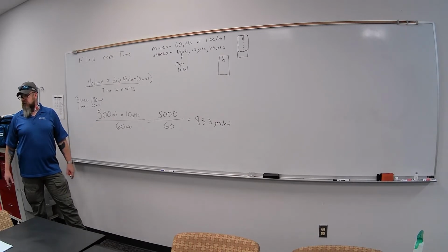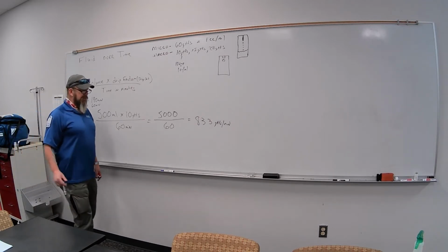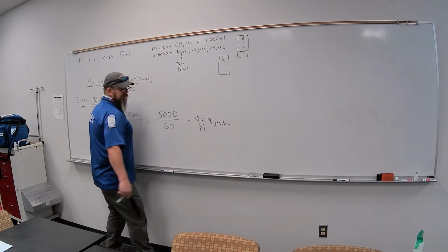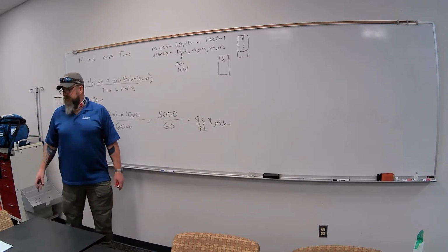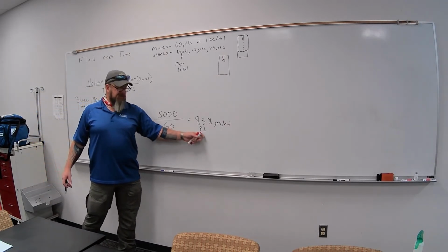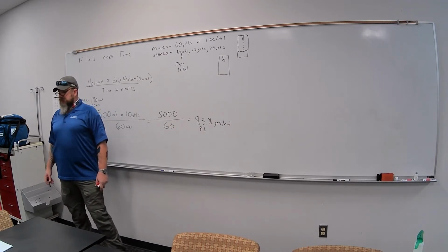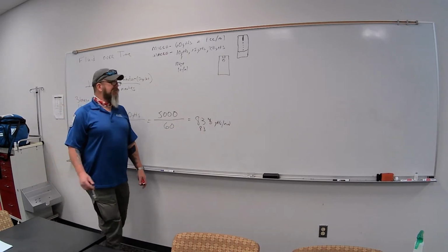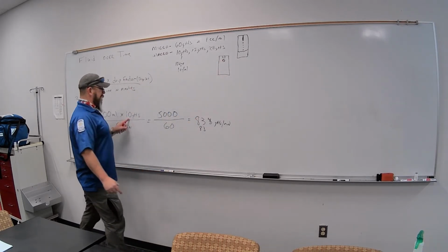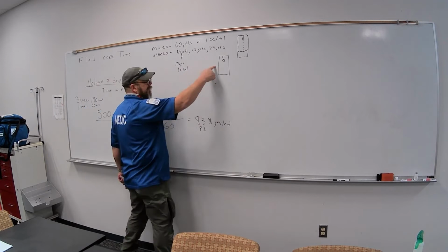Okay, you got a 500 ml bag set up there. Alright? So, because this is 83.3, we'll make it 83, as long as we get in that ballpark, right? This is going to be a little bit imprecise, okay? So how do I figure out how many drops I'm getting a minute? Okay? I have to watch this drip chamber here, okay? Remember, we're in a 10 drop set, right? So it's going to be the big one.